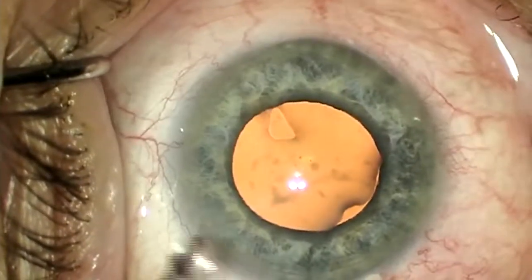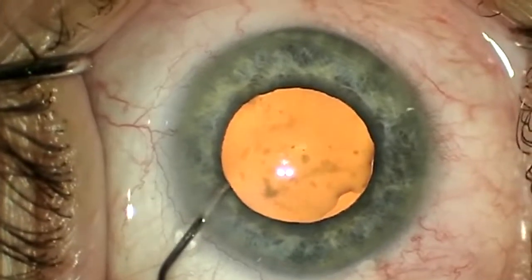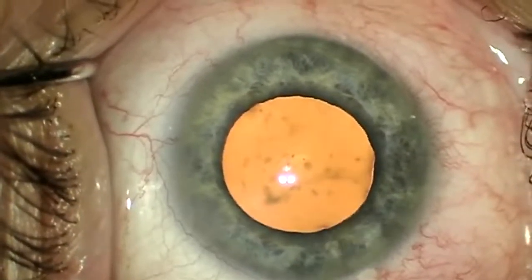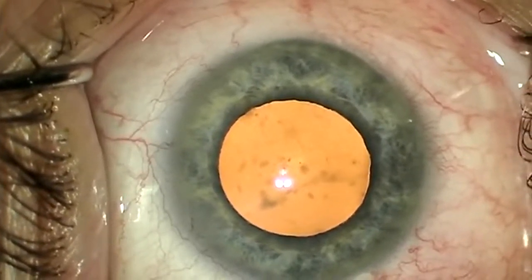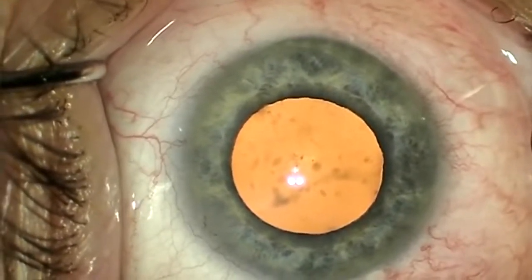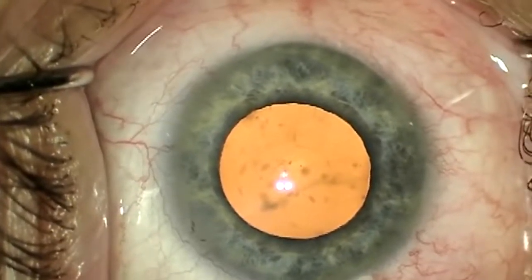I haven't had good luck with viscodilation and I've spent a lot of time trying to convince myself that intracameral lidocaine or epinephrine does anything. The problem with these methods — visco or pharmacologic — is that they may or may not work. The reliable solution is a mechanical expander ring or hooks.